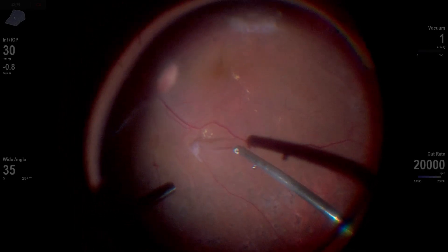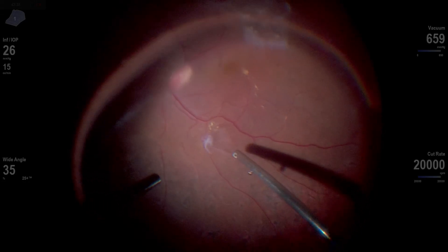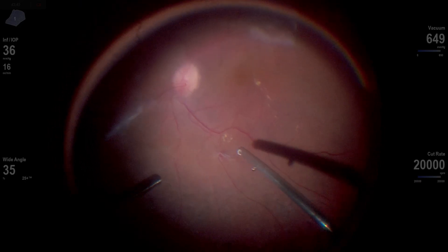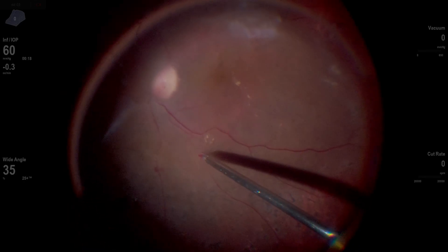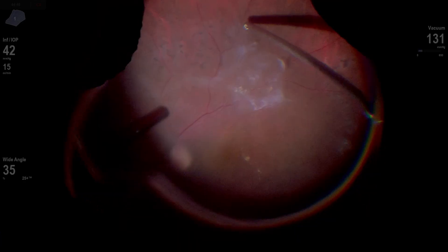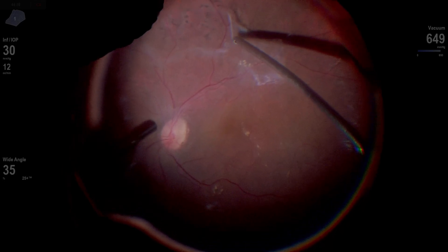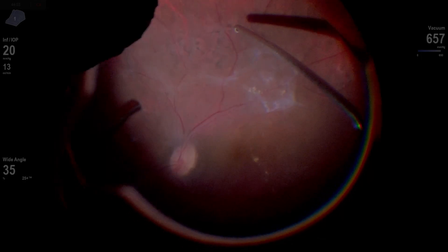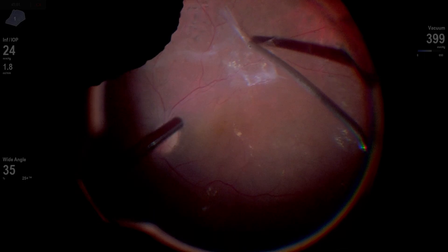That's a really dangerous plaque right there. If you just go in and aspirate and pull, you're going to create a break right there. And if you create a break in a patient with mature and difficult-to-remove fibrosis, you're in trouble and the patient's in trouble. I'm going to diathermize. The one thing you don't want is a lot of blood in a case like this, so I'm going to increase my pressure to control hemostasis. As soon as I see any bleeding, I'm going to take the time to get that diathermy in there. When I was a younger surgeon, I didn't diathermize as much as I should, and it created some difficult situations.